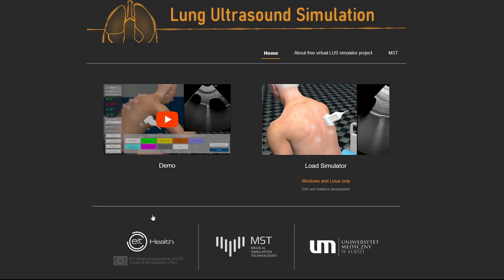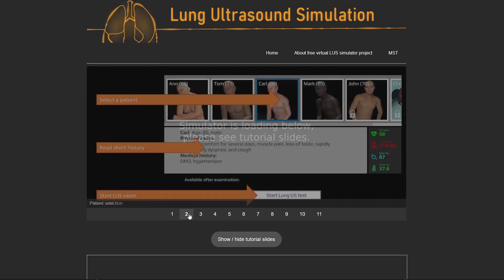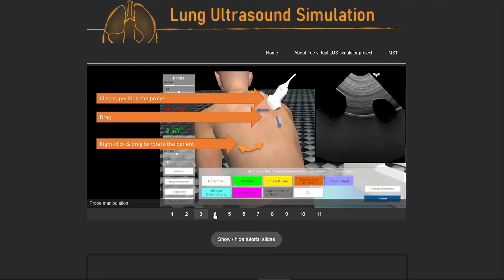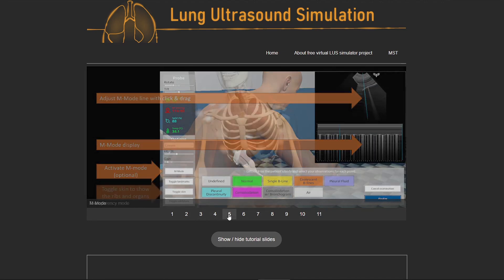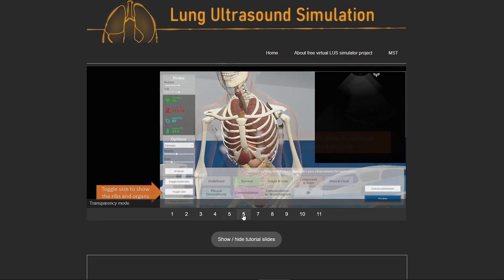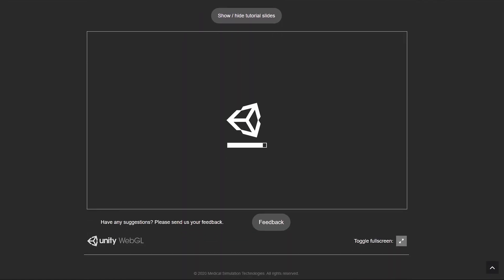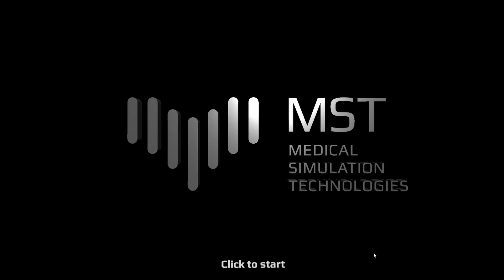This unique web-based lung ultrasonography simulator shows the basics of lung scanning and can teach beginners how to interpret LUS images, typical artefacts, and how to integrate the information to support clinical diagnosis.